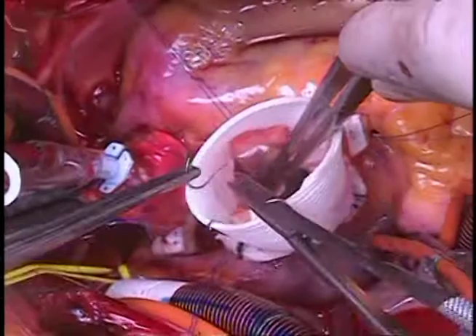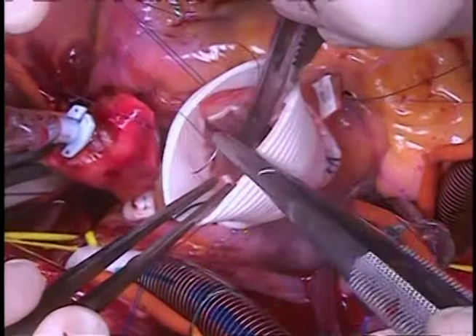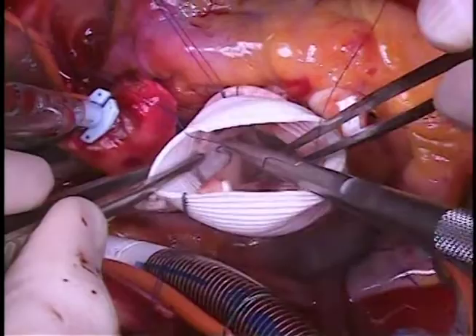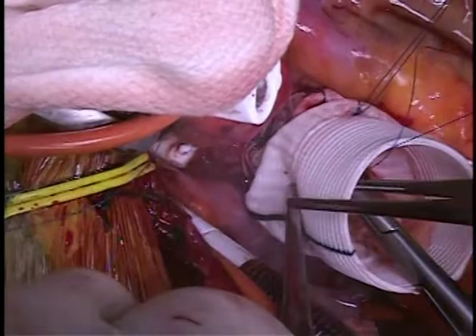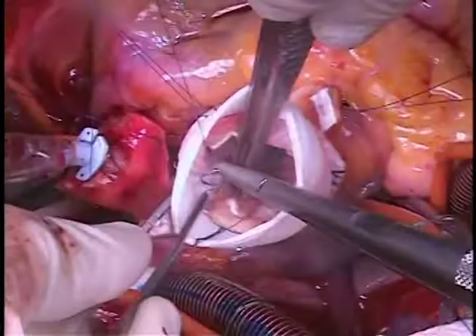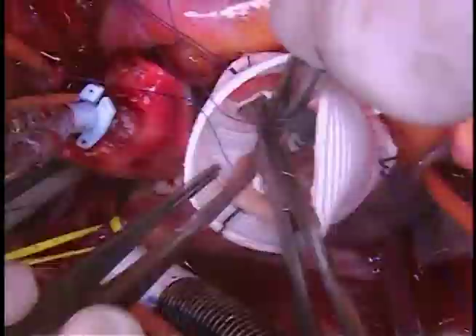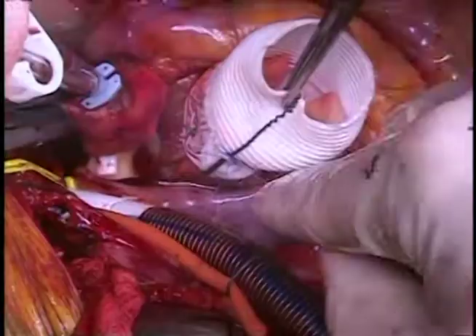Ultimately, you go through your pledget at the top and tie to the previous commissure suture. We do the same for the other sinuses. You'll have to play around with backhand or forehand, and you can always take the needle out through the graft and come back in if you're not lining up the pleat well. This sewing is actually not that difficult to do with this particular graft. Do realize that this is the hemostatic layer of the construct. The subannular stitches only hold the graft in the correct orientation. The running inner suture line has to be symmetrical and precise — you need to get enough aortic tissue but be careful not to encroach on the valve leaflets.